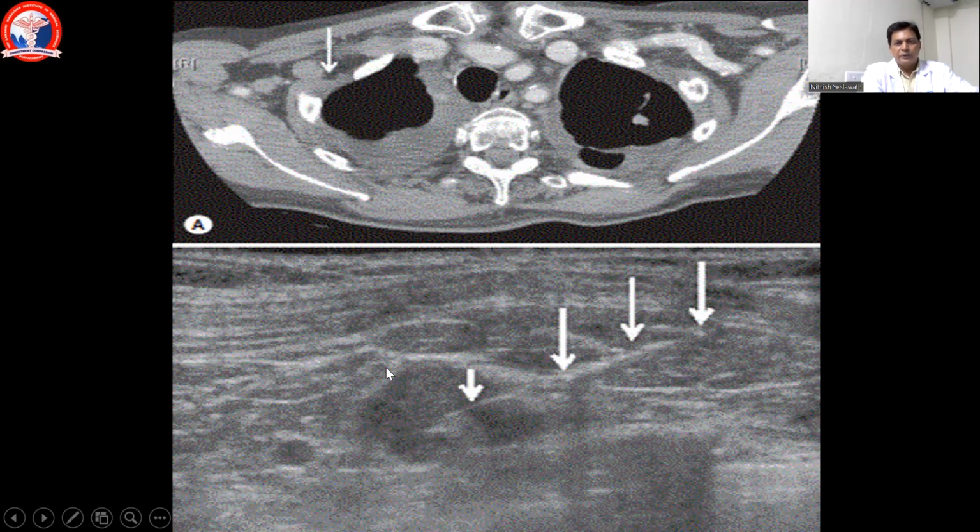Next image is a sonography image of the pectoral region. The important thing here is this node, which is apparently hypoechoic. Through that node, there is a biopsy needle seen here. The arrow is marking the biopsy needle. So this was an attempt to take a tru-cut biopsy for evaluation of the node, and the images are according to that. We'll see the next image.